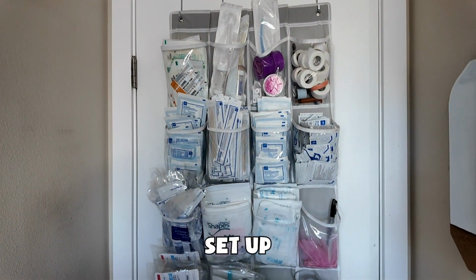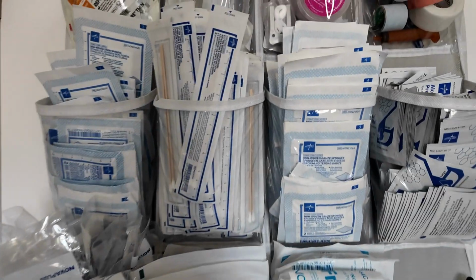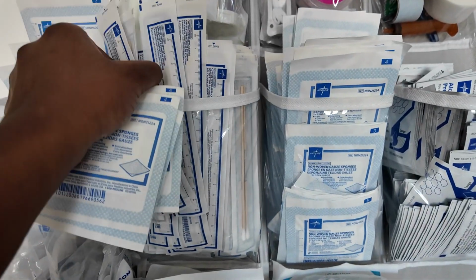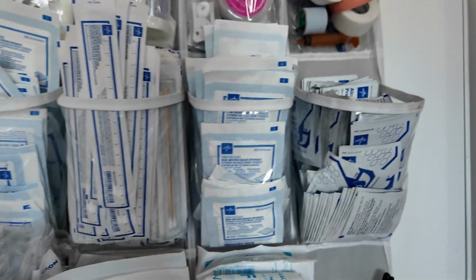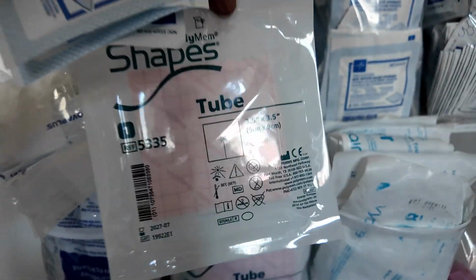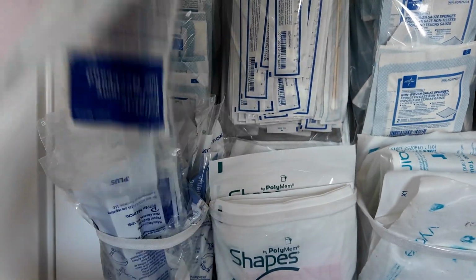A successful trach care session starts with a setup and being organized. So we get all of our supplies through insurance, and we keep it in a shoe organization kit that hangs behind the door, and we have it all so we can see. We have our alcohol pad so we can wipe down the tray. We need gauze, we need Q-tips, we need dressing. This is going to be your standard setup and needs for every trach care session that we have.